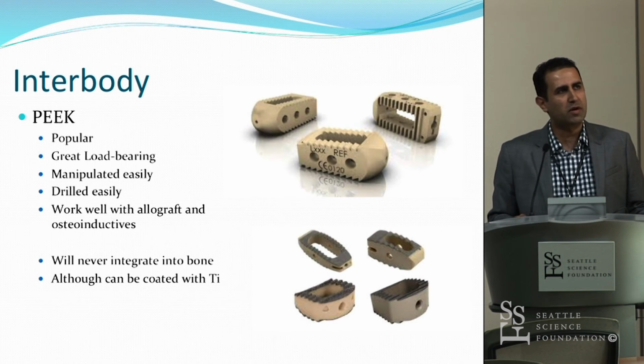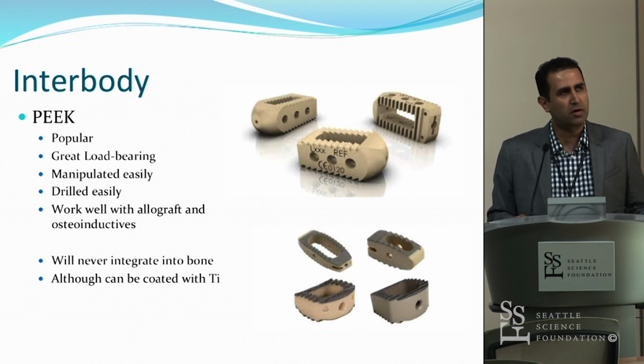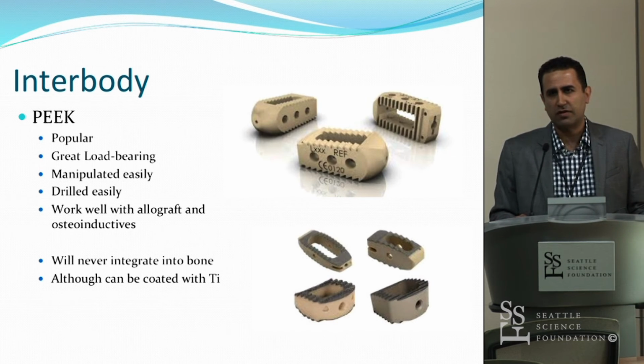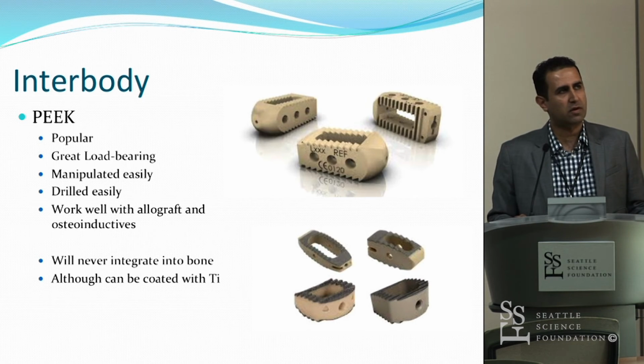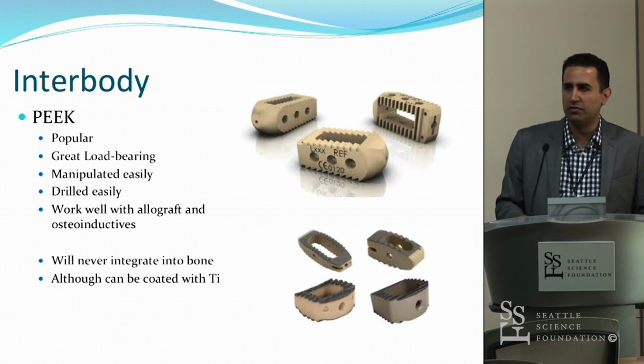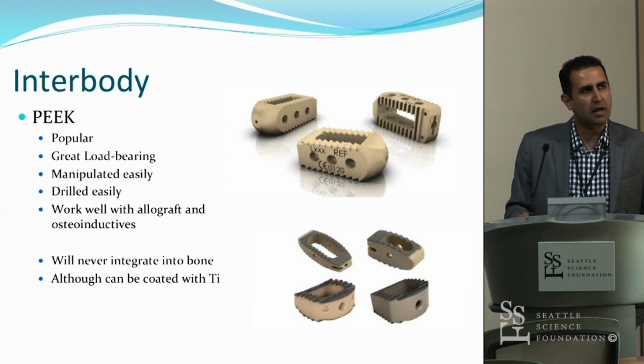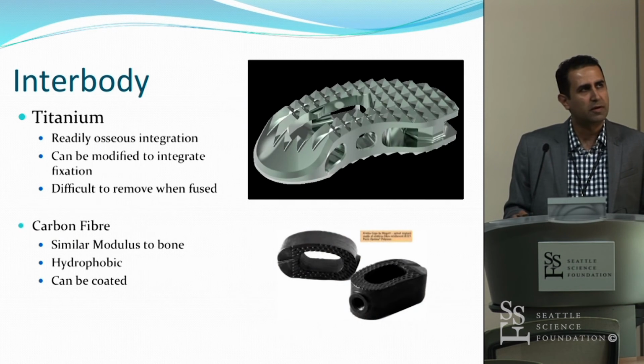And for that reason, some surgeons do not prefer it, particularly in areas such as the cervical spine, where other good options are available. You can coat it with titanium, and that will improve its osseous integration. But overall, it's a workhorse.